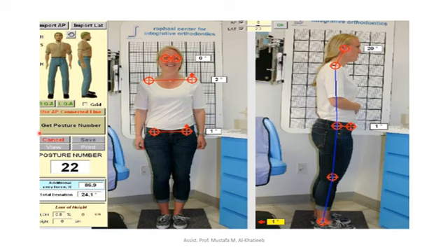There is a software to determine the forward or front view, horizontal view, interpupillary, intershoulder, interhip. This is in horizontal or transverse view, and also the lateral view.